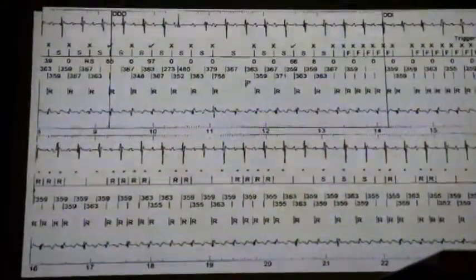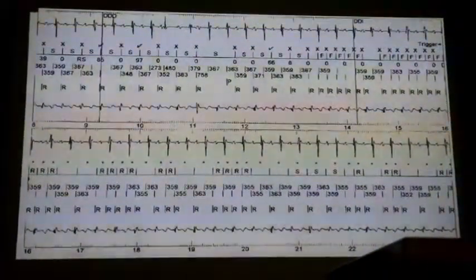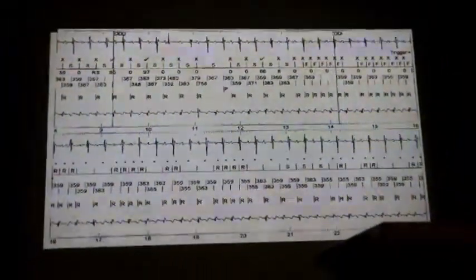We were worried about this guy. We thought, what should we do? He was in clinic, not T-wave oversensing. He was at 4, T-waves are fine. Exactly, exercise: put him on a treadmill. Got him on a treadmill.